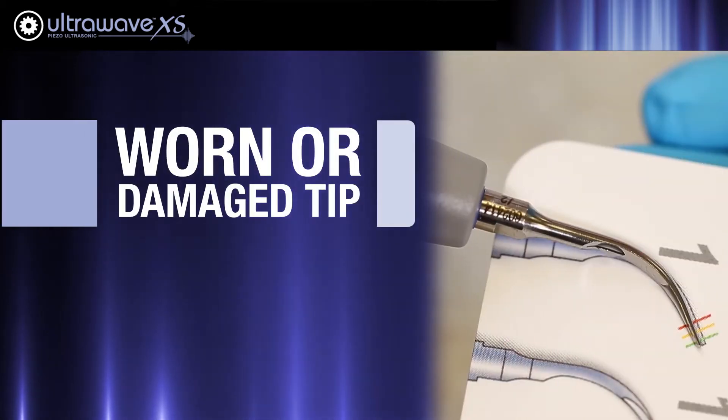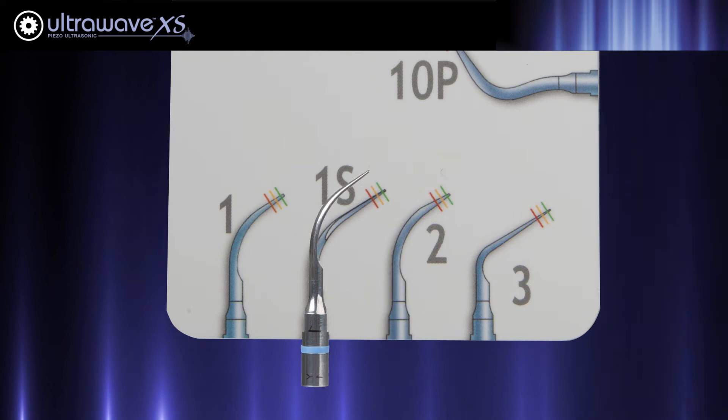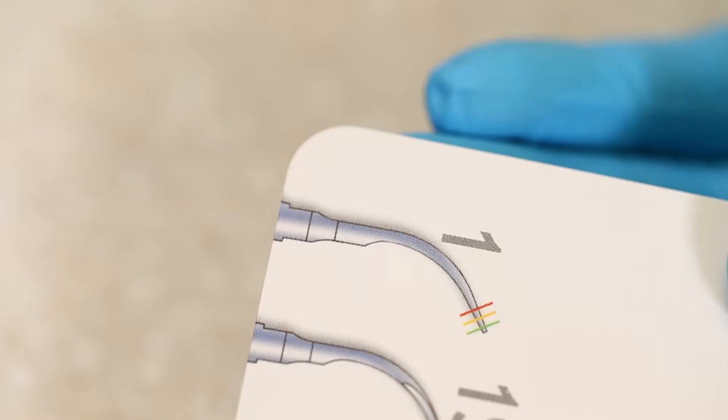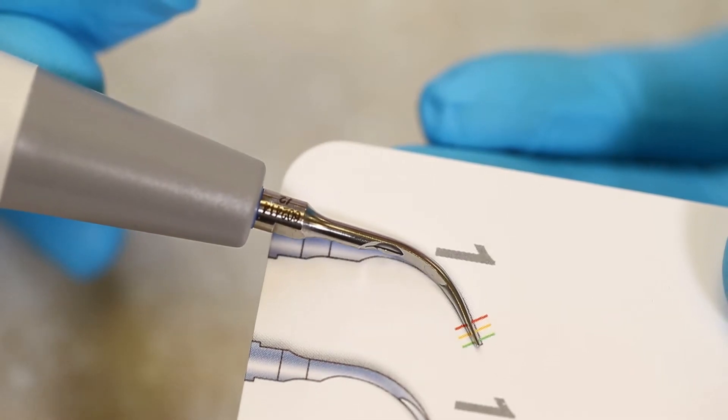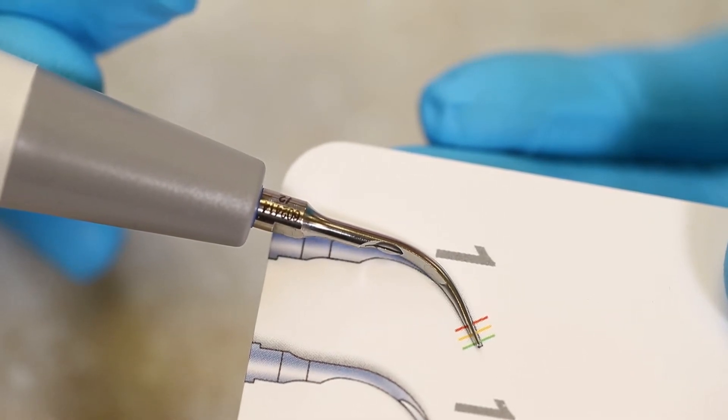You can check this by comparing the tip that you are using to the tip card included with your unit. On the tip card there are three lines. Each line shows how worn down your tip is. If you find that your tip is worn down below the yellow or red line, it should be replaced with another Ultradent Satellac tip.